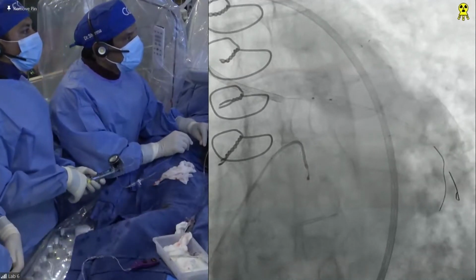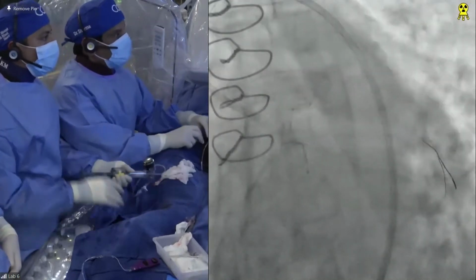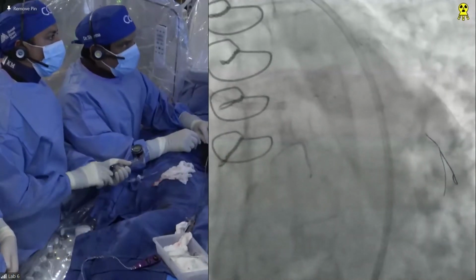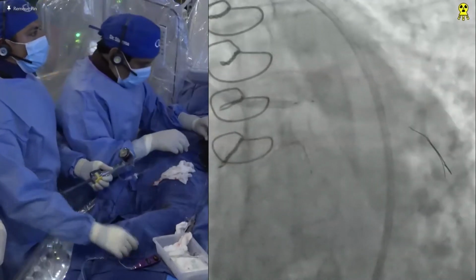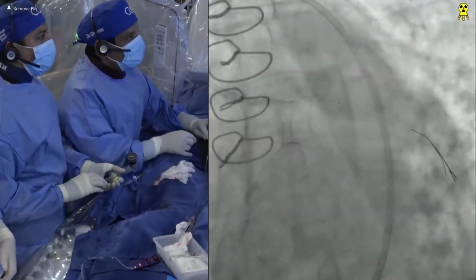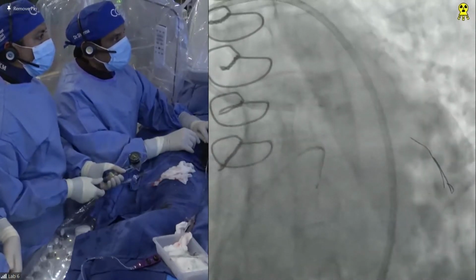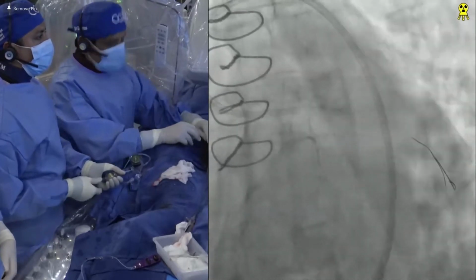I'm hoping that in the case of an underexpanded stent, re-stenting should do, or maybe even a good balloon dilatation, but I saw a lot of tissue inside of the stent. I think you require another stent. Yeah, go up. Of course, we have taken away all the coverings and we have to go slow. So no matter what you do, you get a 3.0 cutting balloon also. Although in the stent I am not sure it is going to work, the cutting balloon will be, but we'll go very slow. I was going to ask him next about the cutting balloon. Yeah, 3.0 cutting balloon. We are getting a 4.0 to 22 atmospheres. Otherwise also with your balloons, when this happens, you go slowly.